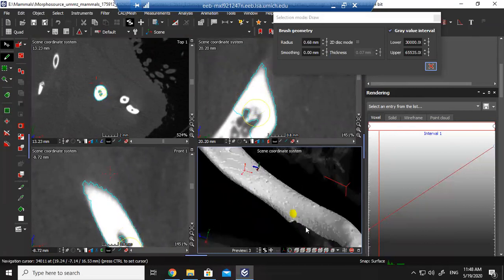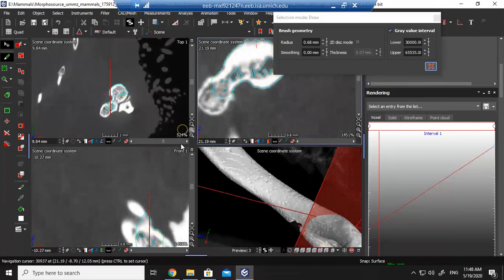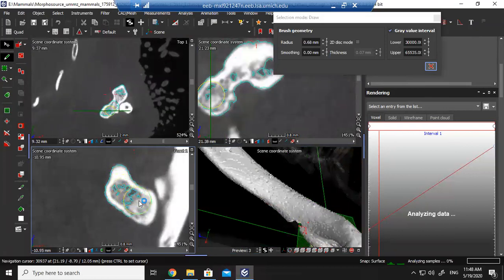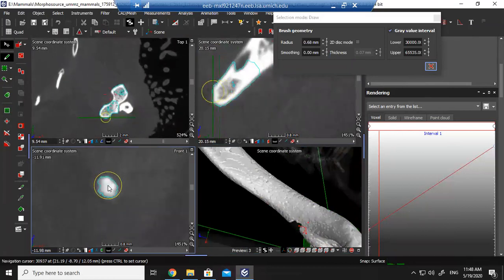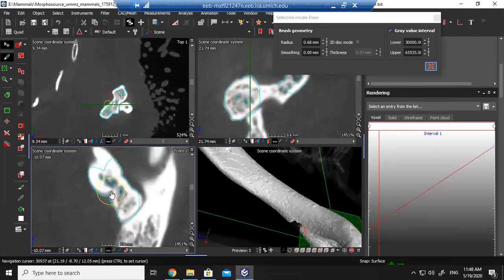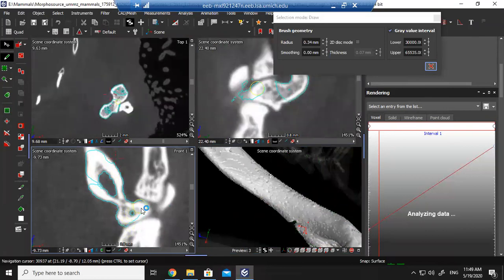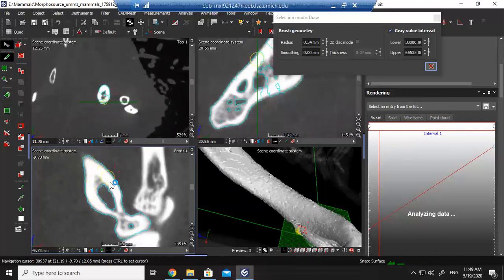So I'm going to go ahead and finish this humerus. It won't take too long. You just have to be a little careful, and I like to work in one view as much as possible, and then switch over to the other views. So in this case, I'm just going to use this view down here at the bottom left. You can see I'm just clicking and dragging, and it is filling in the element. And now here in this more complicated articular region, I've decreased the size of my painting tool. And over here, go ahead and do that too.